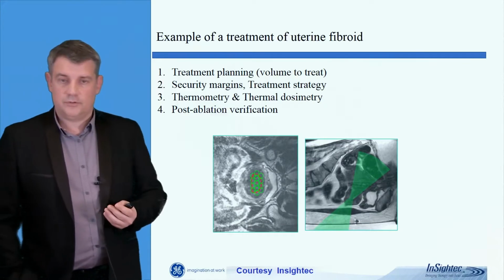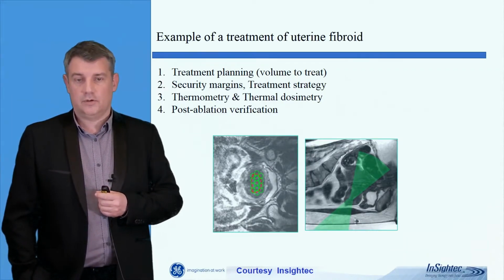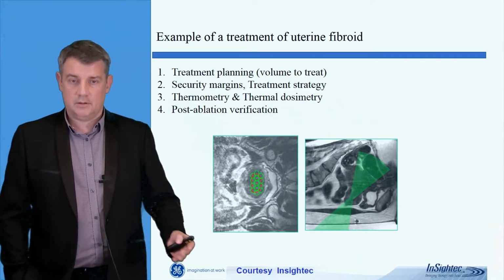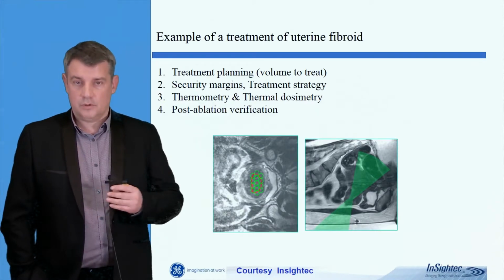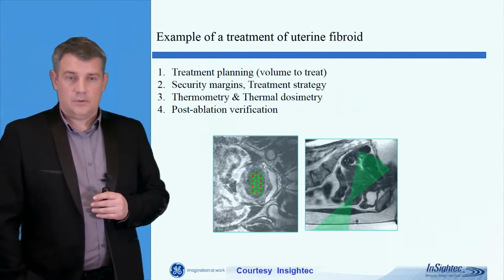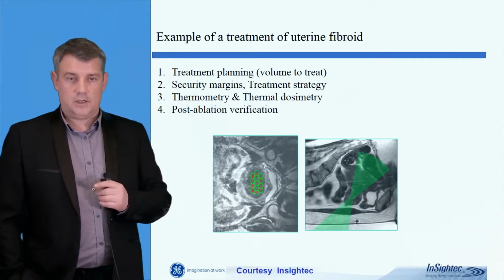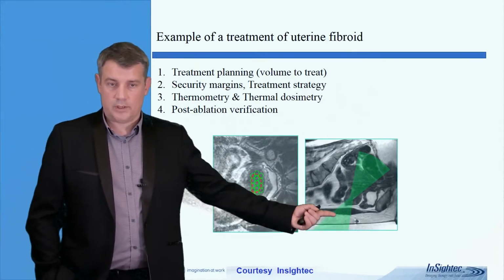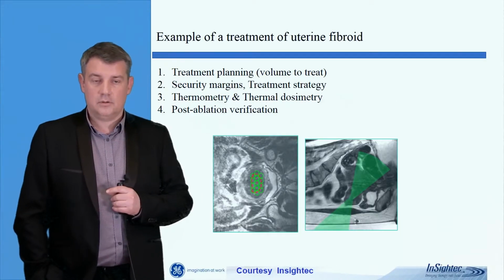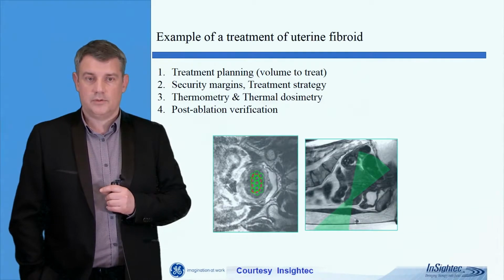Then, after completion of the treatment, I'm going to make post-ablation imaging to verify that the treatment that has just been performed, while the patient is still on the table, corresponds to the treatment planning. The advantage of MR, for example, can also be seen on the right. You can draw on the 3D images. You can represent the cone of propagation of the HIFU here in green, and you can then check that you are not going to send acoustic energy to a very sensitive structure, like for example the sciatic nerves.